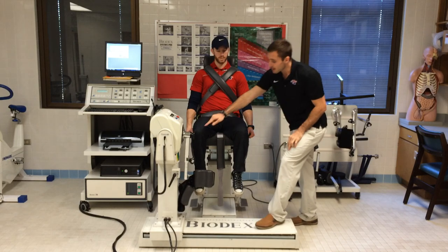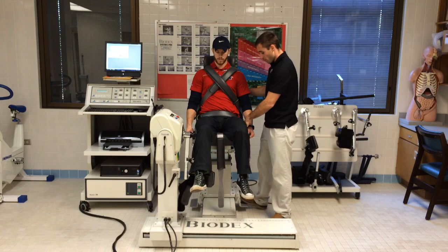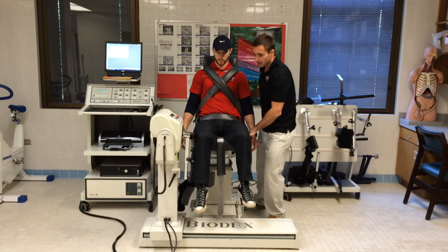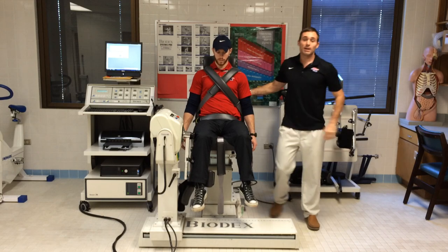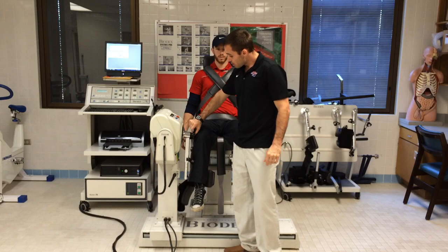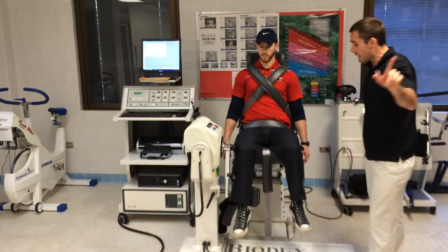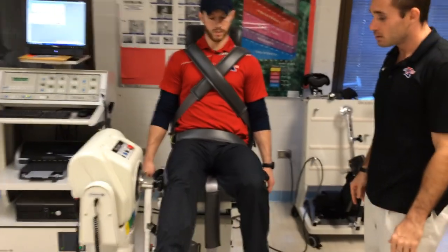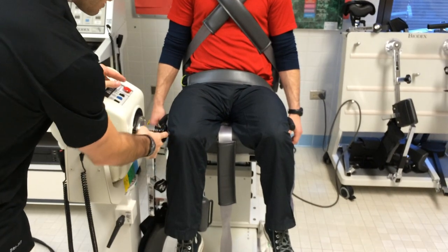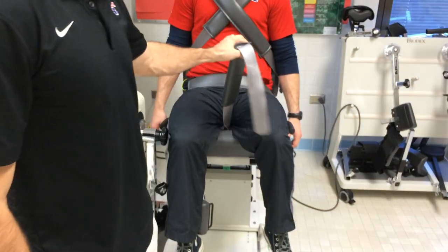Now I'm going to ask Bo to take his leg and bring it on top of this piece, so that I can finish moving him forward. I'm going to move him forward. Just relax your leg. Make sure that chair locks in. What I'm looking to do is line his knee up with this black piece. It's going to be his axis of rotation. If you bring your leg all the way out and back, does it rub on it at all? Okay, we want to make sure his leg is close, nice and lined up, but not rubbing against this, which could end up hurting him.